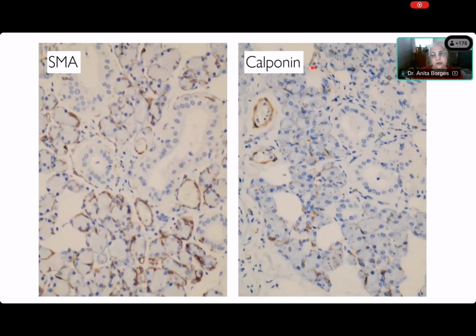Now myoepithelial cells, again, we talked about the fact that they're called myoepithelial cells because they have a contractile protein. And here is smooth muscle actin, and you can see the myoepithelial cells around the smaller ducts and around the acini, all showing expression of SMA, that's smooth muscle actin. But note that there is this big duct over here, and very occasionally you will find a myoepithelial cell there. The majority, and those of you who attended my first lecture will know, the myoepithelial cells are concentrated in the acini as well as in the intercalated ducts. There are a few myoepithelial cells in the striated ducts, and this SMA is a nice exposition of that.